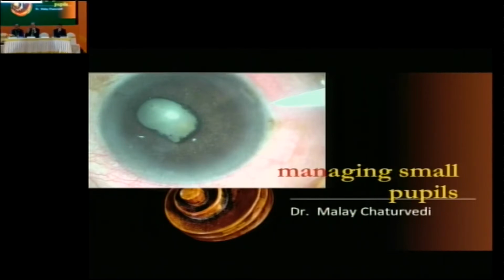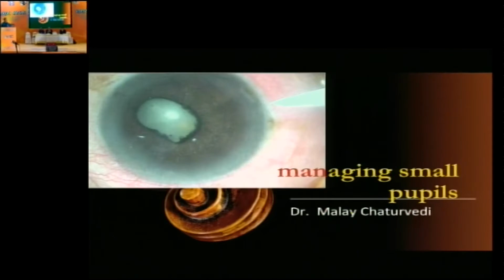If the soft cataract has a little bit of brittleness, that happens with the senile soft cataract especially, then you can use some sort of chopping technique or cracking technique, and then like divide and conquer. That kind of technique can be used in these soft cataracts.